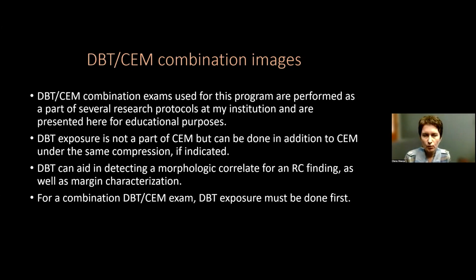I would like to point out that the cases I will present to you today are going to be a little unusual because the majority of the cases I will show you were done within a few research studies at my institution. And I thought that having these cases will help you put together contrast mammography and digital breast tomosynthesis side by side. DBT, or digital breast tomosynthesis, is not a part of contrast enhanced mammography. Contrast mammography is really a 2D exam, but we do them together just for research purposes.